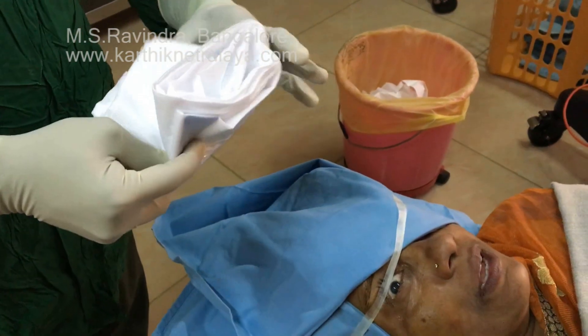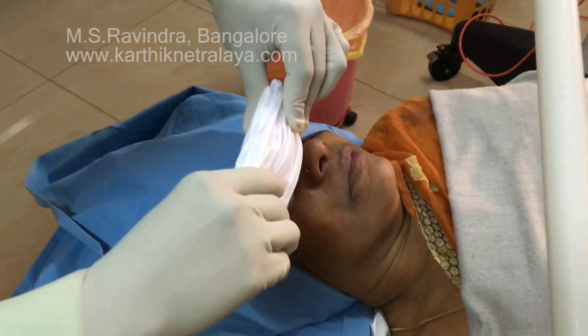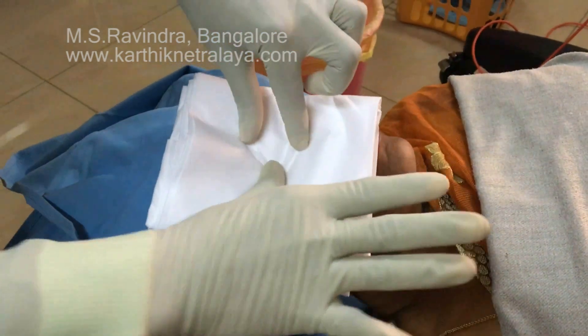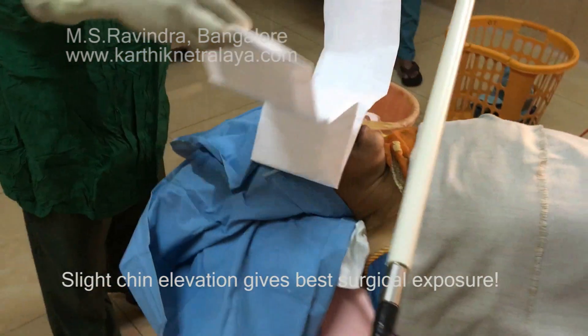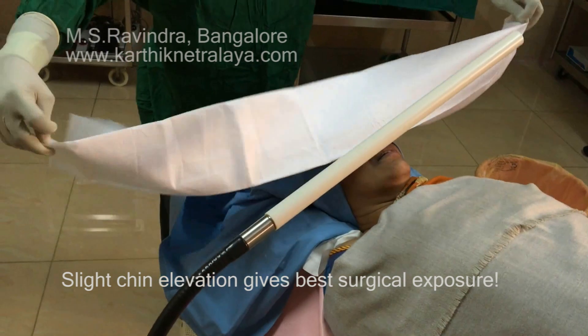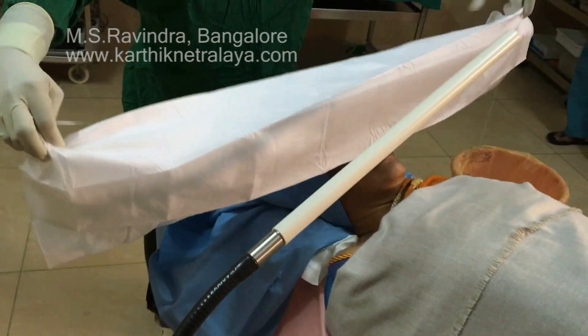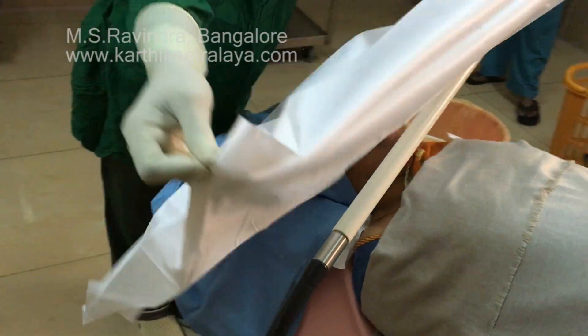He holds the two ends of the tape and grabs the upper lid, asks the patient to look towards the forehead, and then gently — without any pressure — places the tape across to hold the upper lid lashes. He then applies the drape and unfolds it onto the chest of the patient, with a pipe or rod lifting the drape up as it is unfolded.